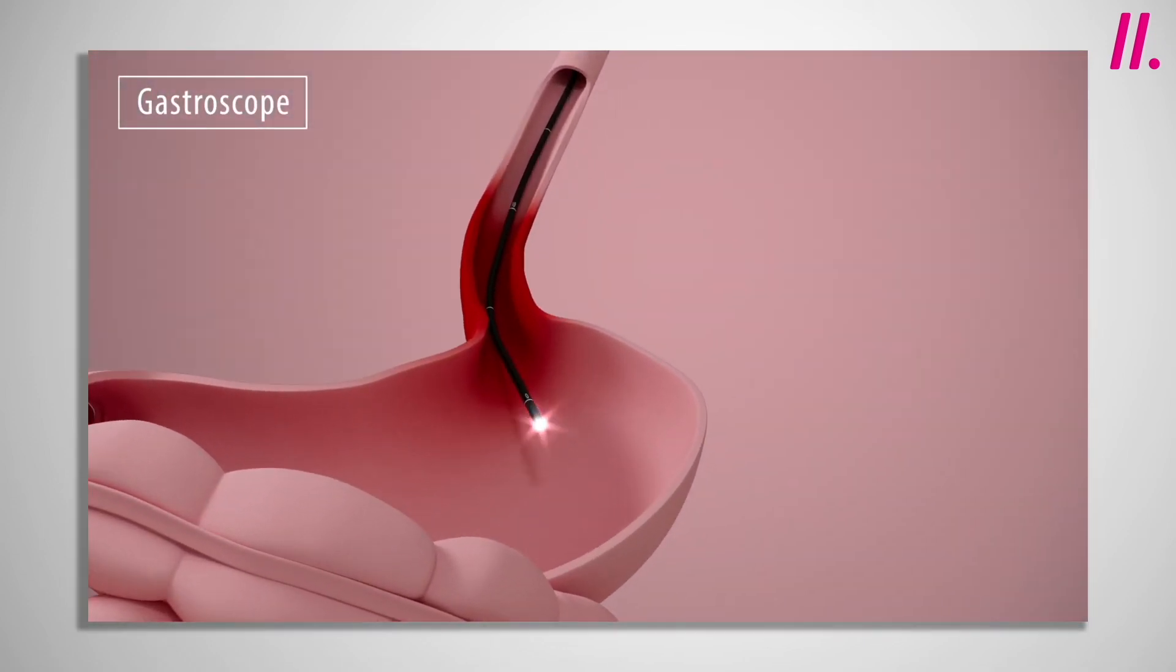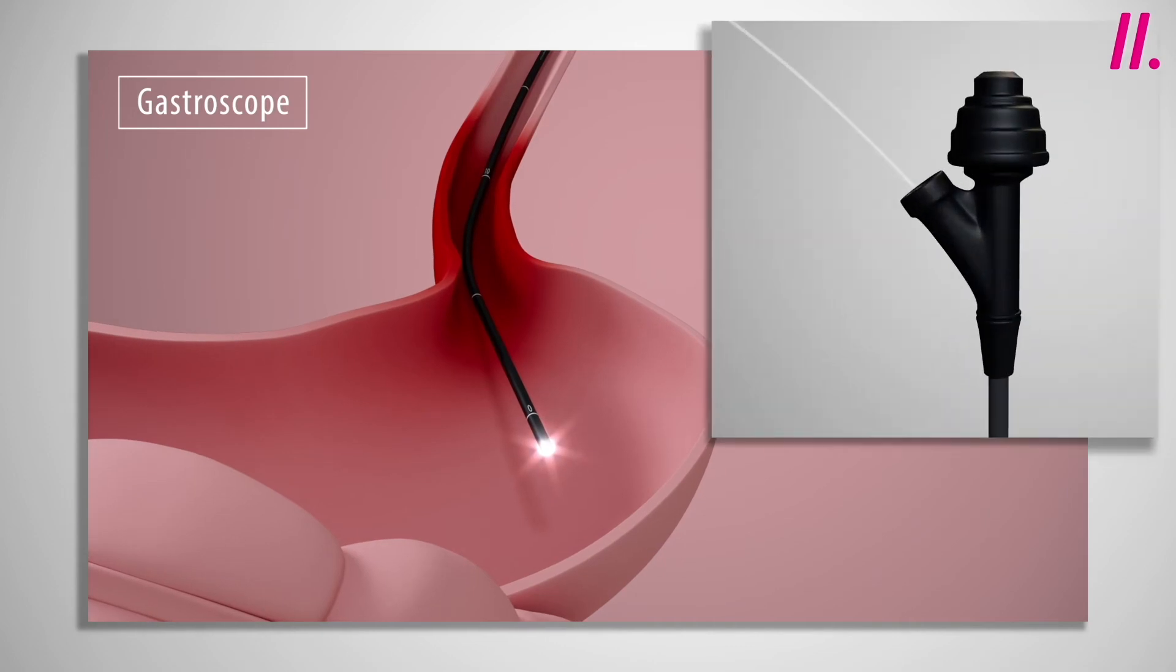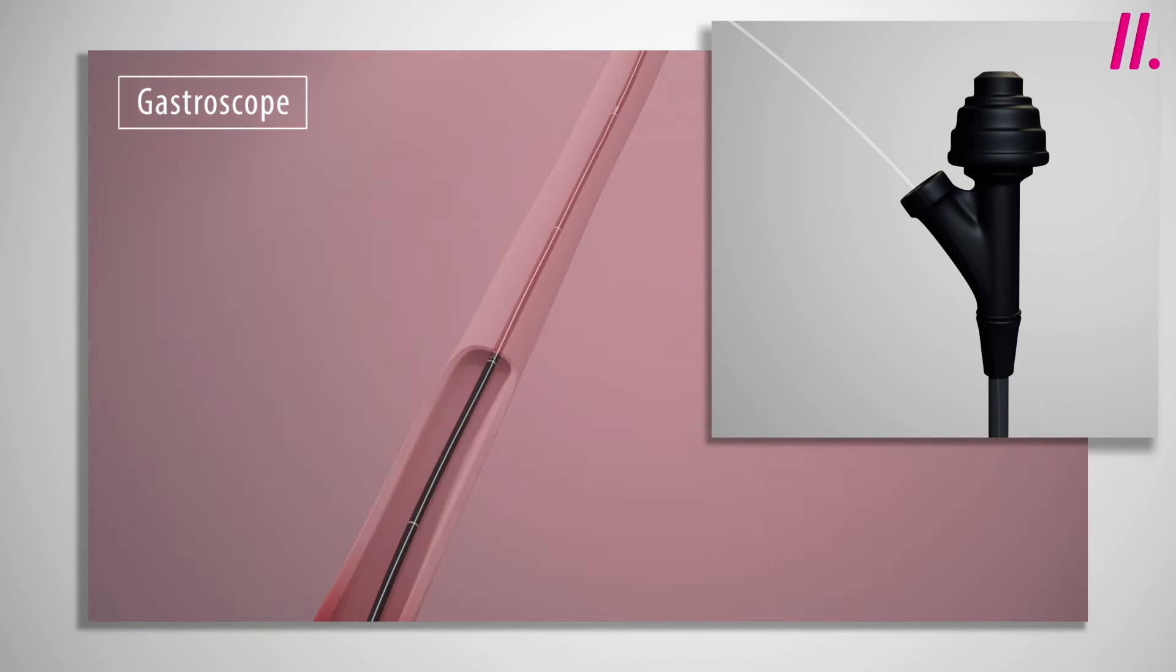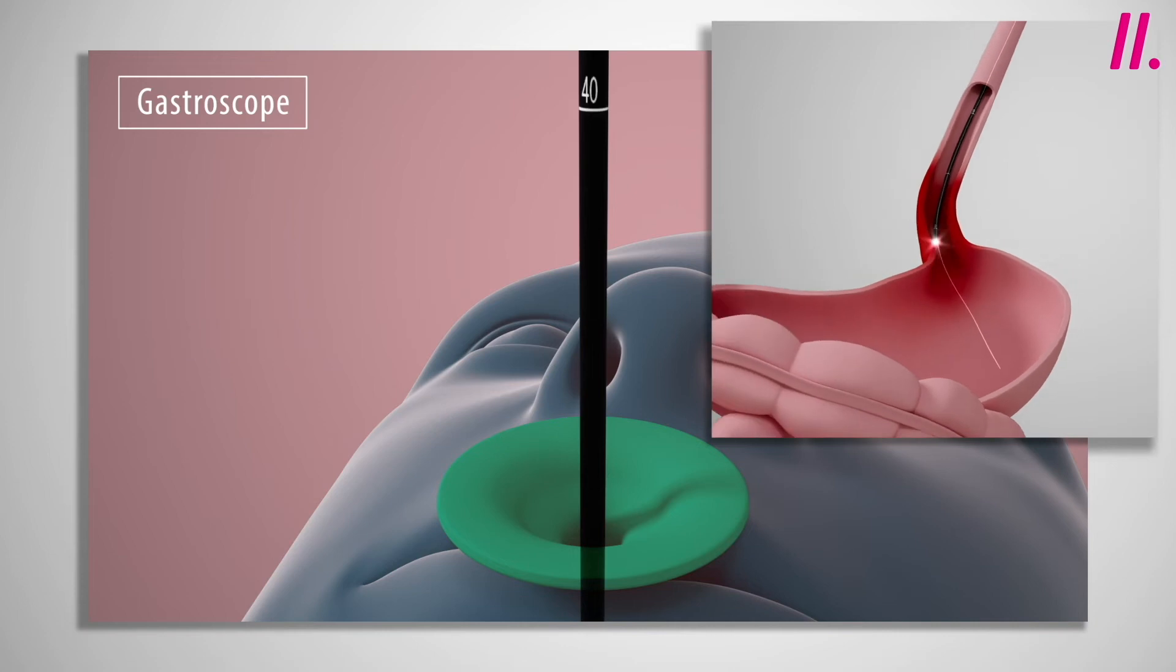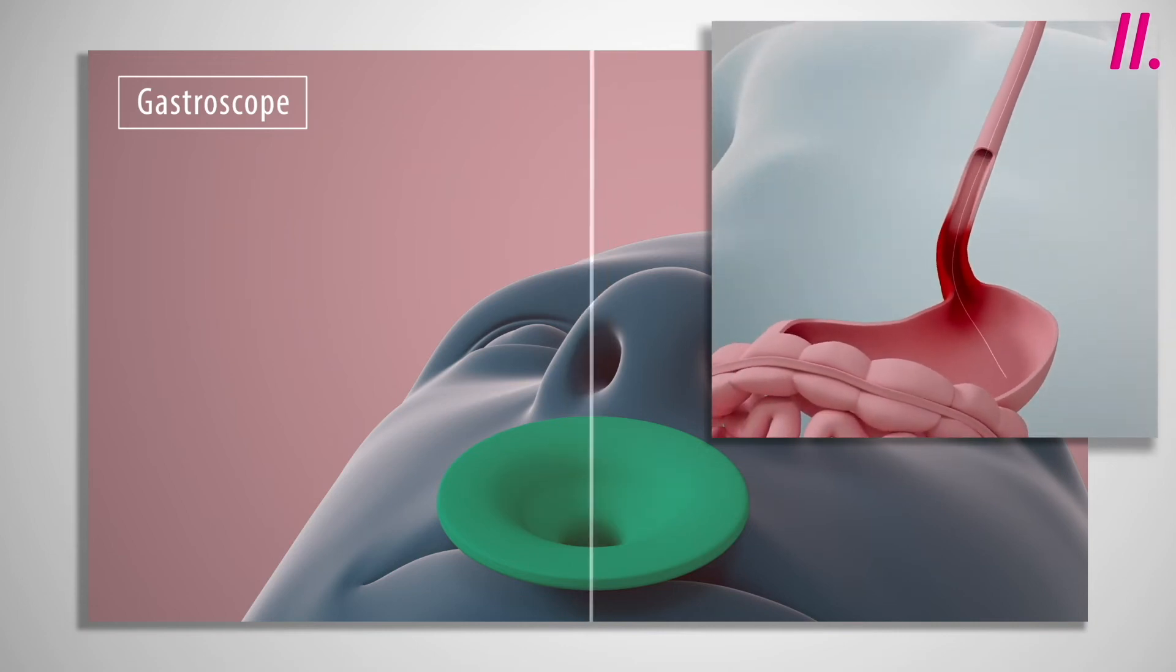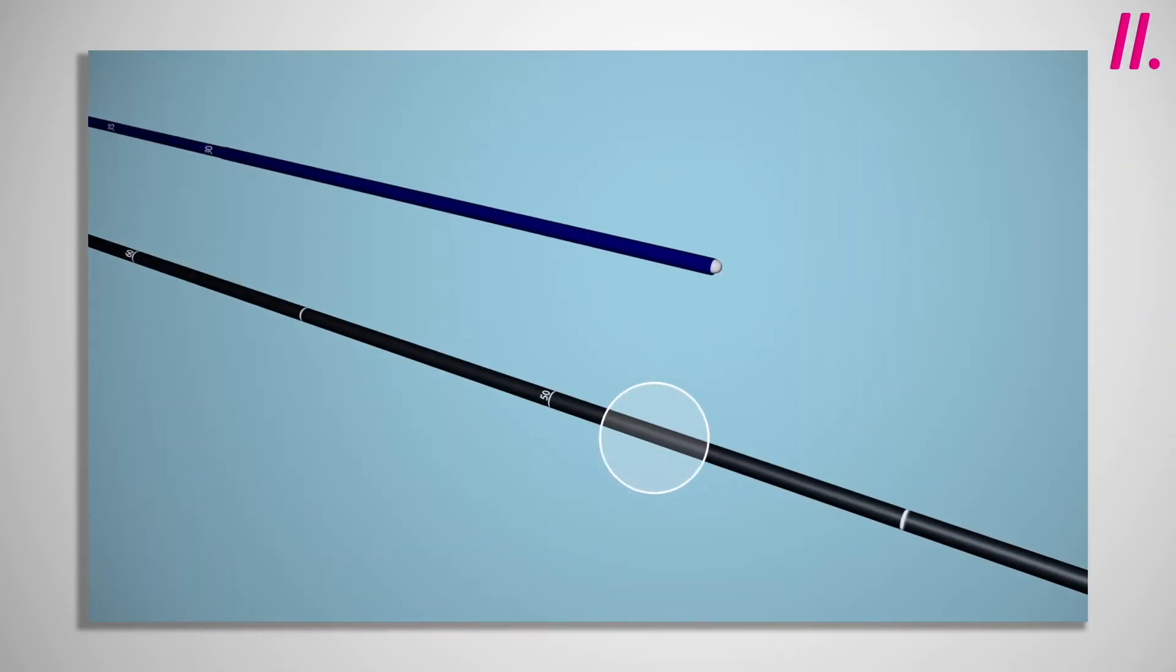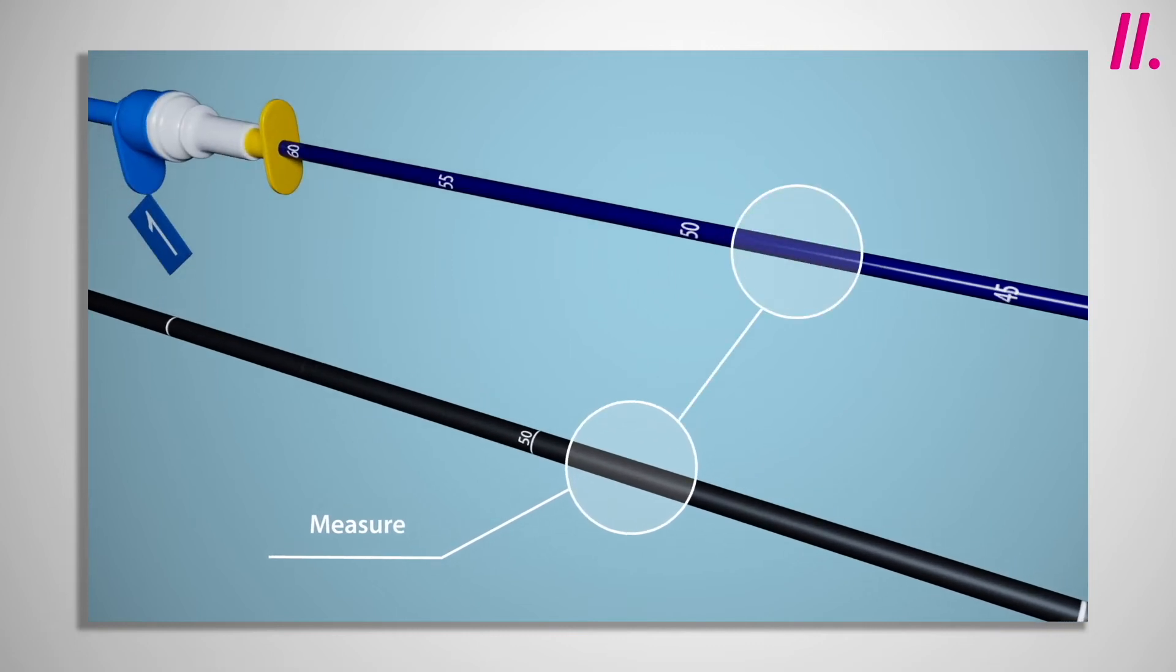A 0.035 inch wire within the Danis pack can be placed at gastroscopy to aid placement of the stent. Before removing, the gastroscope is used to measure the distance from the gastroesophageal junction to the mouthpiece. Add 5 cm to this measurement and then advance the yellow protecting plate and ring to this distance on the stent delivery system.